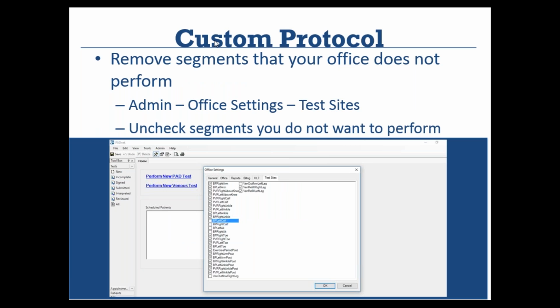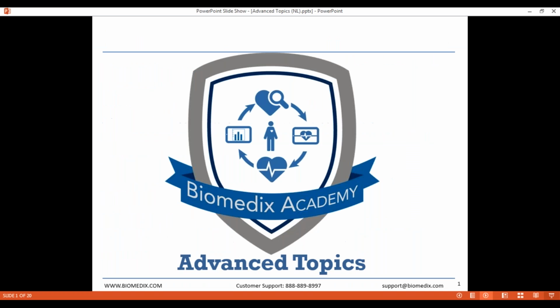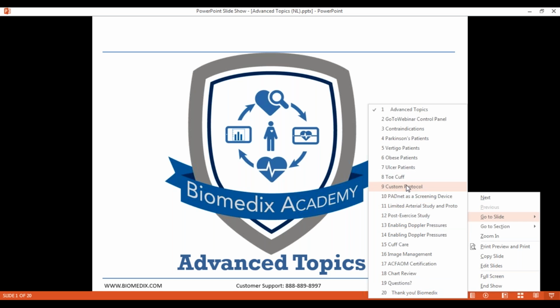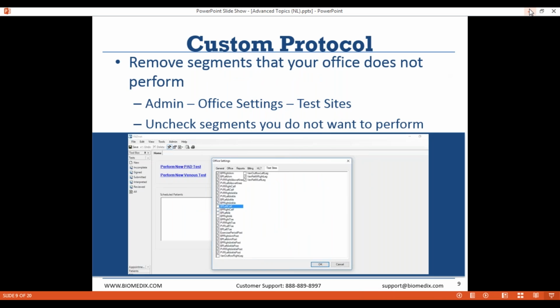You do have the ability to customize our protocol. If, for example, you never or rarely ever perform toe pressures, it can be a little aggravating if the system prompts you to do that every time. By the same token, if you never perform a post-exercise study, you can do that as well. Just give me a moment here. I will get back to where we were in the slides, and then I'll show you in the PADnet testing software where you can customize the protocol.